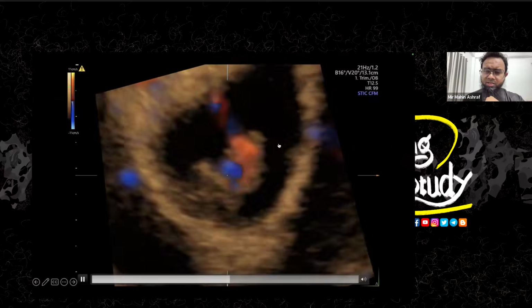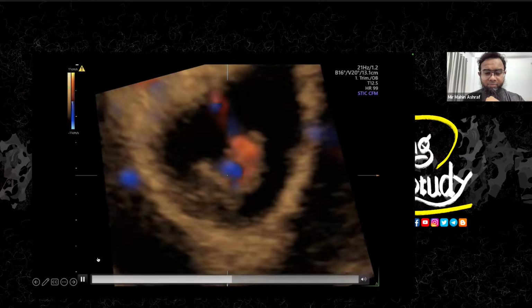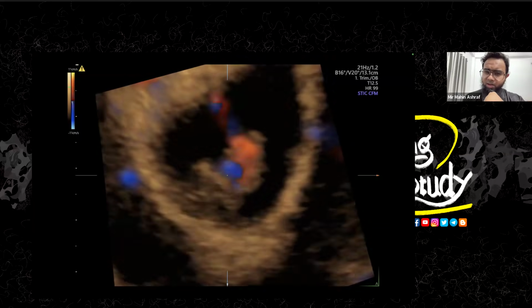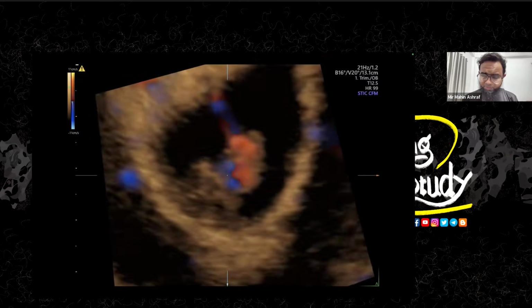Using Doppler is extremely safe for early pregnancy ultrasound. Make sure we are using ultrasound as a safe technique for pregnancy. Already books have told that. So if you think ultrasound can cause harm to the young baby in the womb, it's totally an unwise decision. So Doppler is extremely safe in pregnancy.